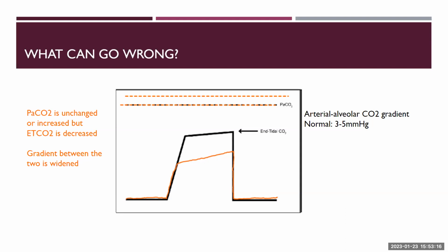But once you intubate the patient, you would probably know whether it was successful or not within a few breaths. This is more of whether there is a persistent widening in the delta in these two measures. So like a dead space issue, or if there's some other issue with the lung itself. That makes sense.